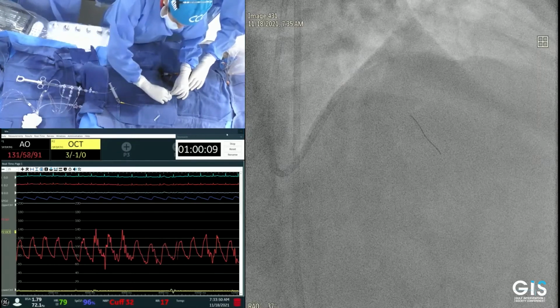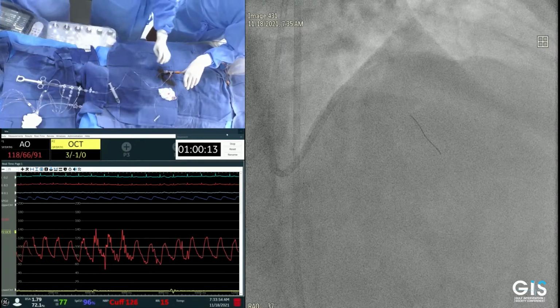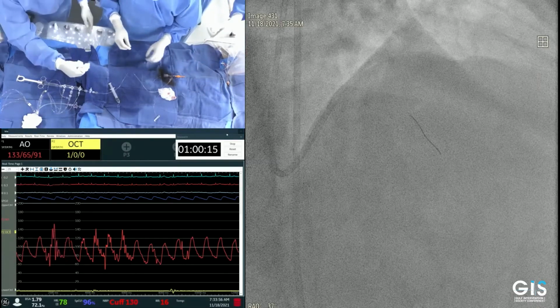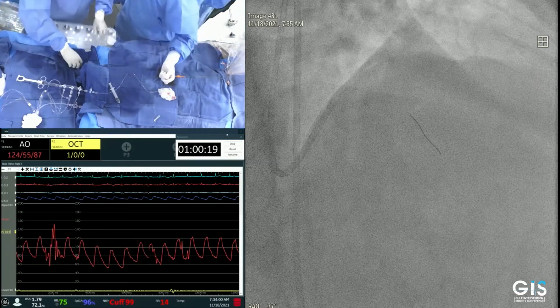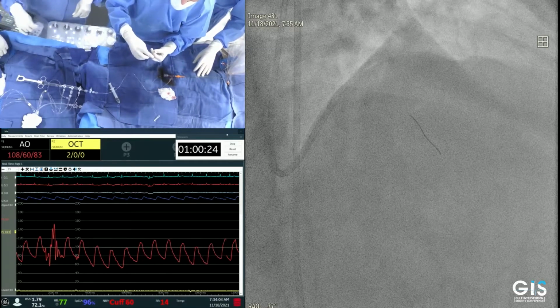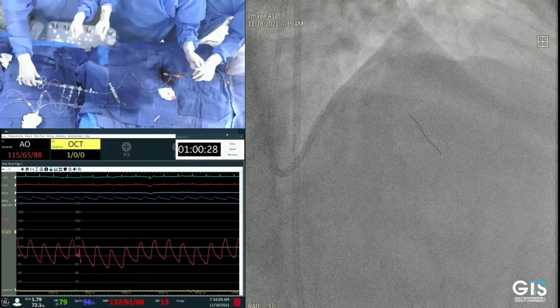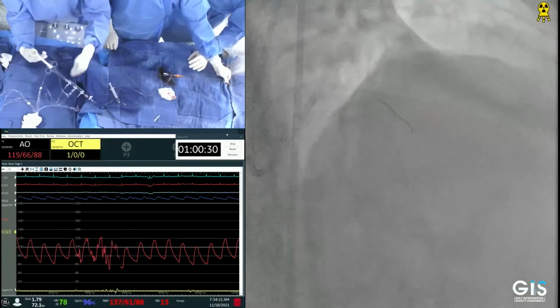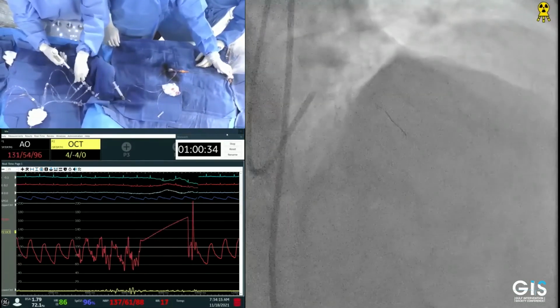If anyone in the panel could please talk a bit more loudly, I cannot hear very well. Maybe I can increase my volume from the control here, please. Yes, it looks fine and fascinating to have preparation of the region before. But my question is, how could the imaging system you use, the OCT, help you to choose the modality of a pre-preparation of the lesion?